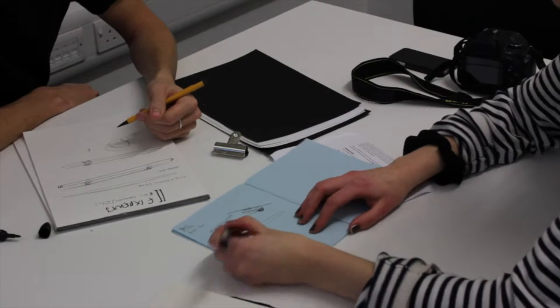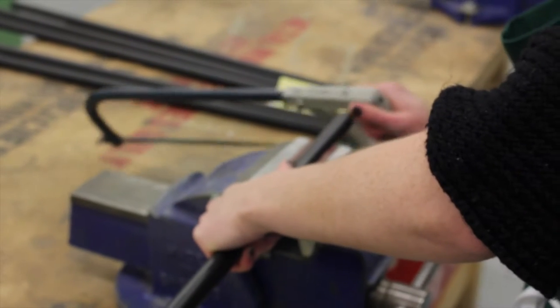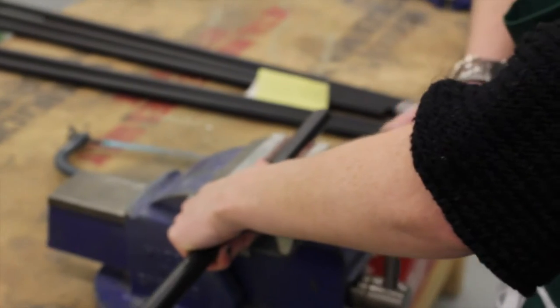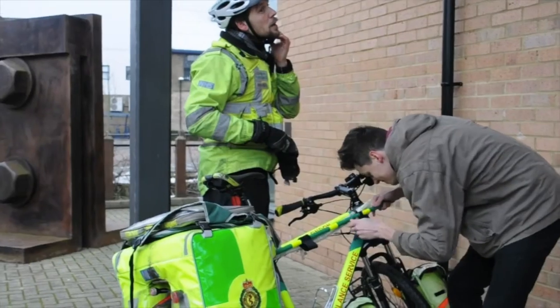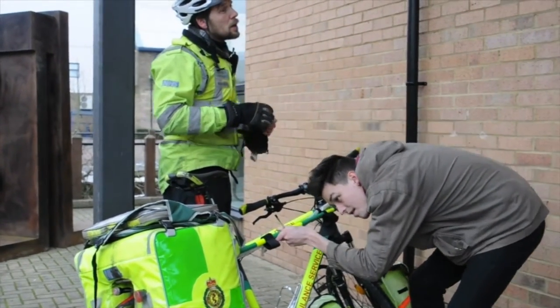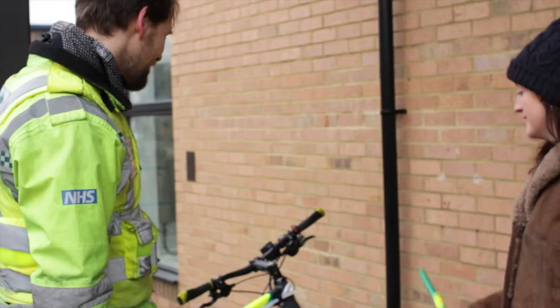We decided to design a durable waterproof plastic casing for the catheter, also known as a Bougie. It can be fixed to the bike easily using buckle and Velcro straps. We wanted to use the same dayglow yellow and green as his bike to keep it consistent and for high visibility, which is important in his job.